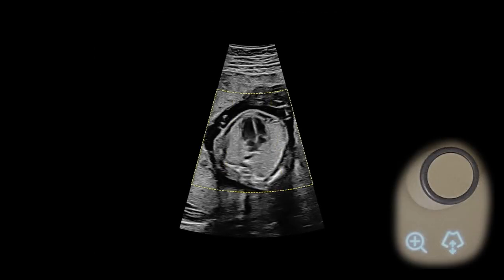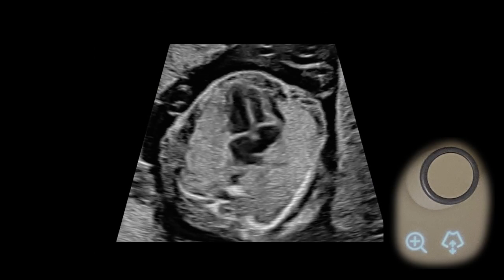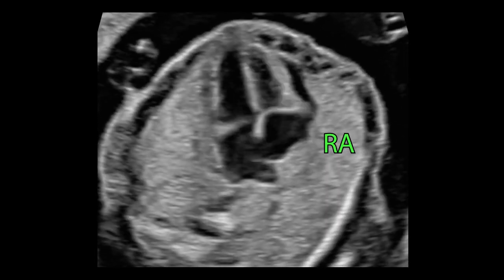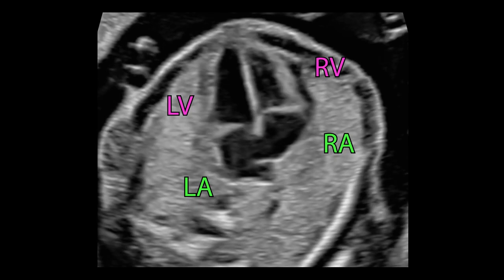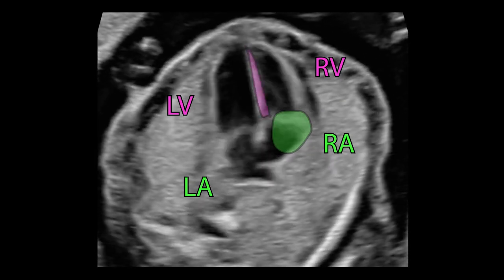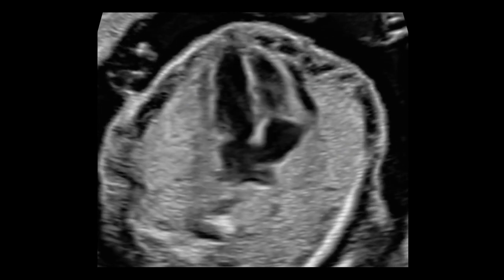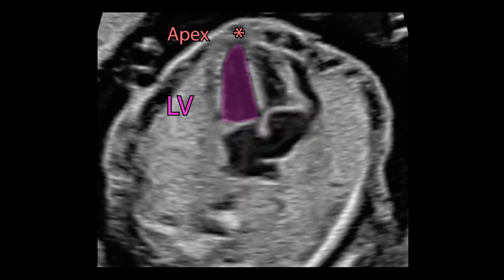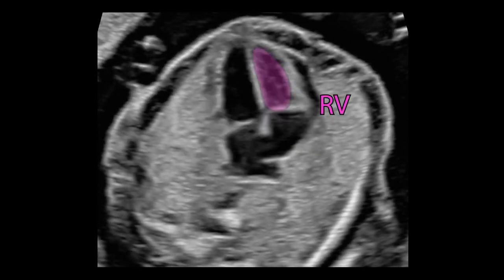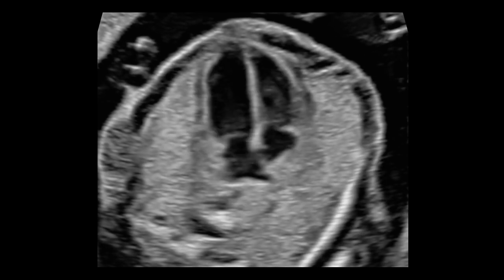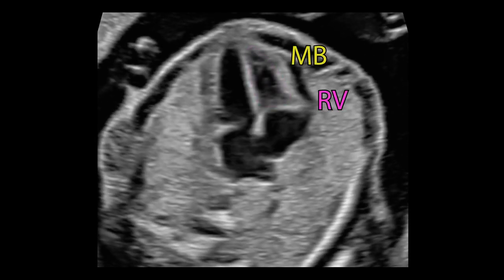The image should be magnified until the heart fills at least one-third of the screen. Confirm the existence of four chambers and evaluate the symmetry between the atria and the ventricles. The left ventricle reaches the apex of the heart. The right ventricle is adjacent to the chest wall, and the moderator band can be seen in the tip of the right ventricle.